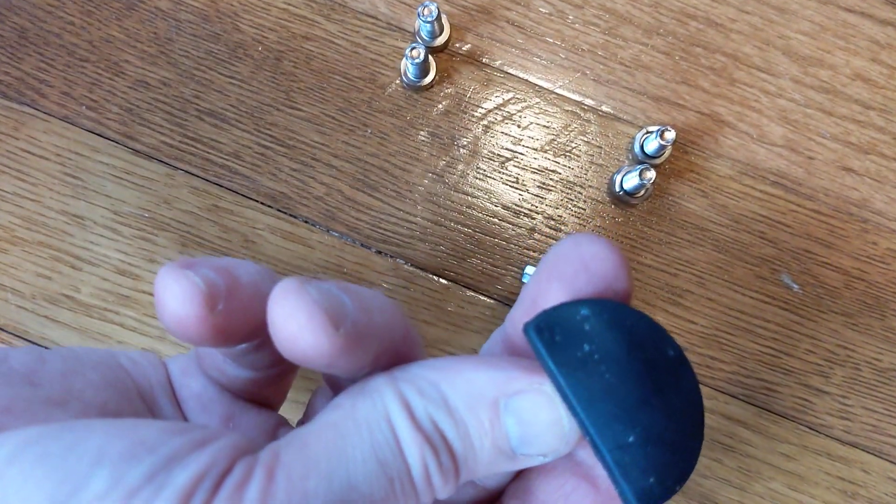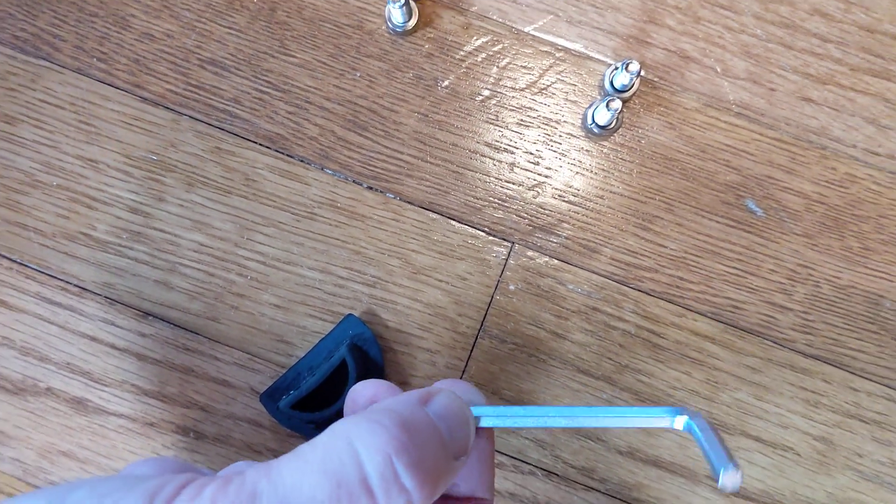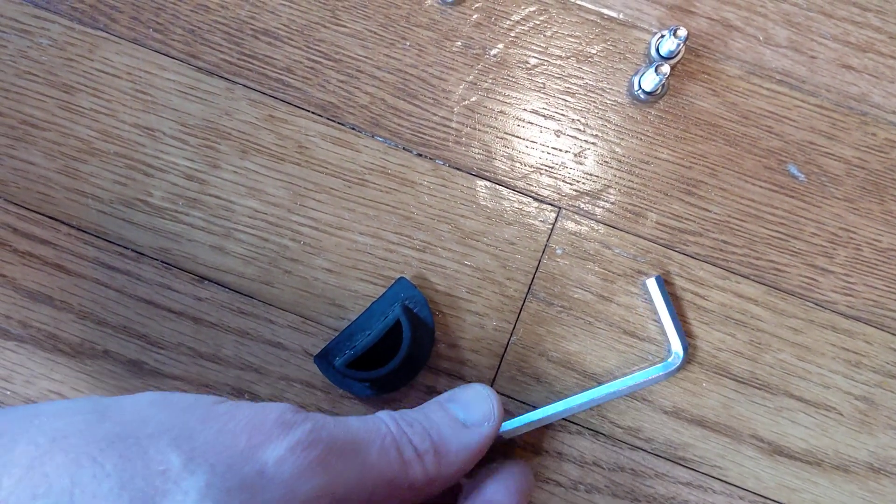We have an engine cover and the allen wrench that actually comes with the chair — the larger of the two fits perfectly — so there are no additional tools necessary.